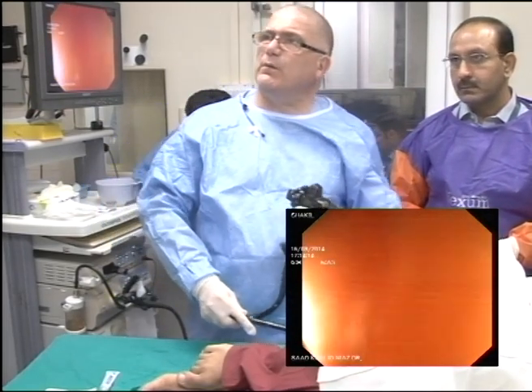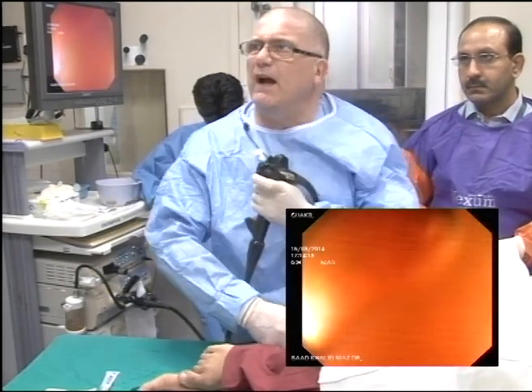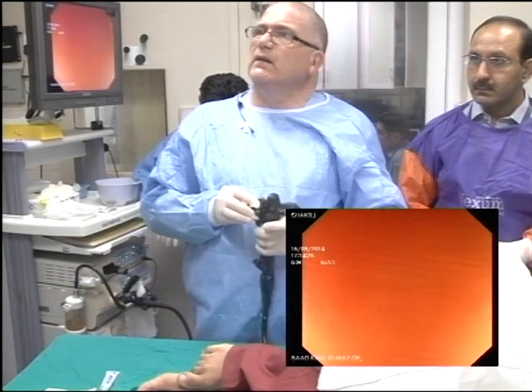Now this is coming back to where we were talking about reducing loops, and it pushes you back if you haven't got anywhere for the tip of the scope to go. Now you can see where the tip of the scope wants to go.